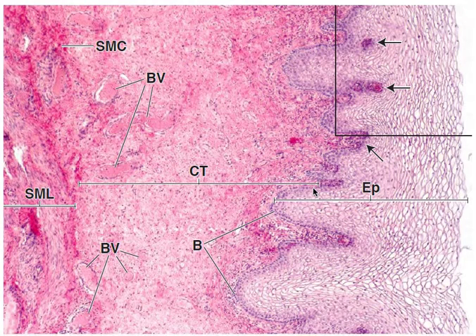Connective tissue papillae project into the underside of the epithelium, giving the epithelial connective tissue junction an uneven appearance. The papillae may be cut obliquely or in cross section, and thus can appear as islands, sometimes right here. The epithelium is characteristically thick, and although keratohyalin granules may be found in the superficial cells, keratinization does not occur in the human vaginal epithelium.